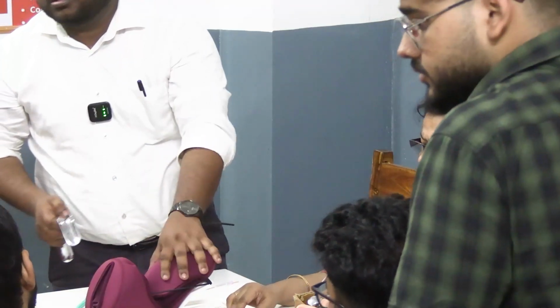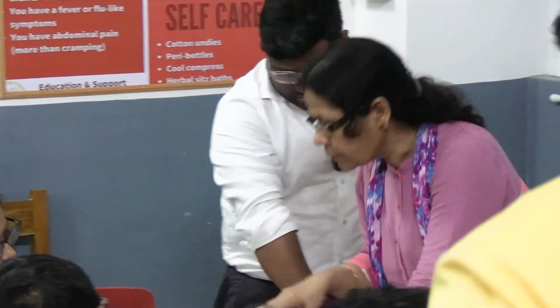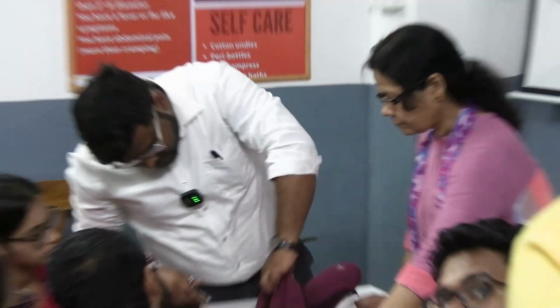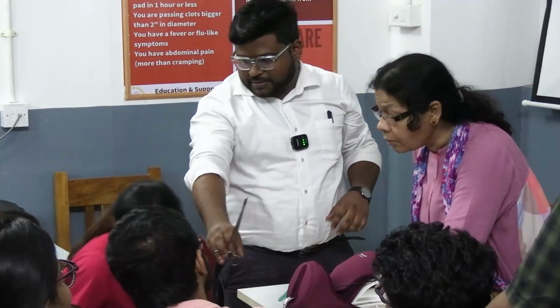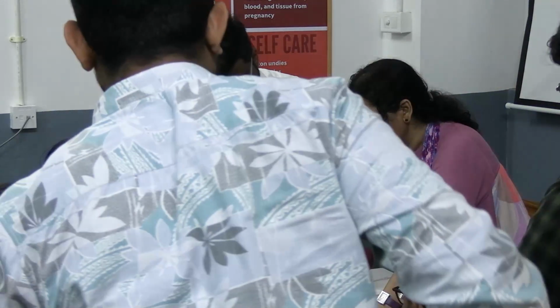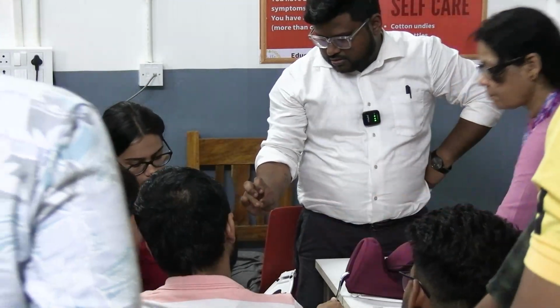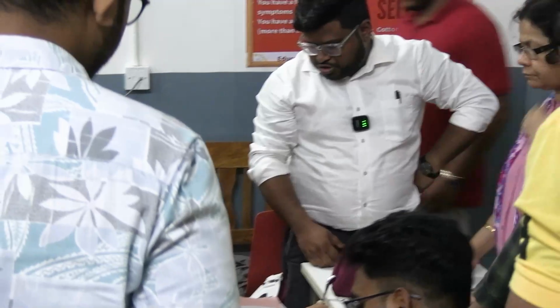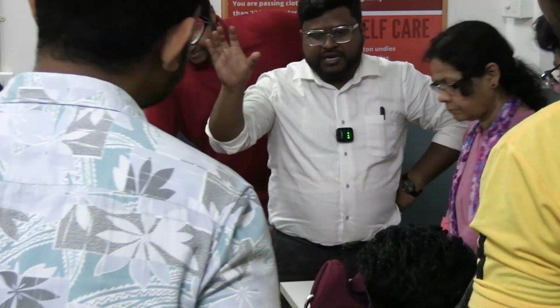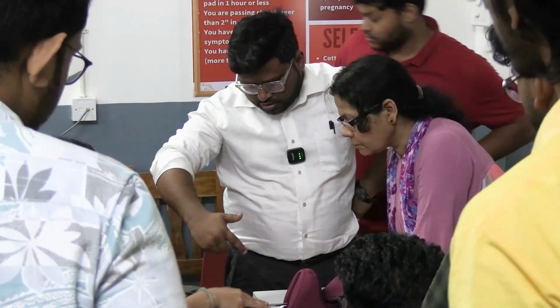This is where your patient is lying in lithotomy position, okay? Insertion. Hold it somewhere, someone hold it. Is the cervix visible? Where? The cervix isn't visible. Hold the cervix. Someone else hold the speculum. See, the up and down movement, one push. No instrument will be separated laterally, one up, one down. Yeah, pronate your hand.